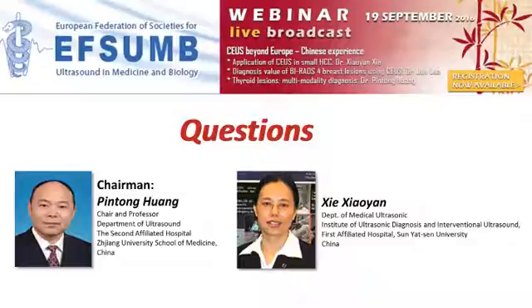It takes about 2 minutes, which is enough, because we have animal experiments. We know that when I use the ablation mode, we can occlude vessels up to a size of 1.5, which is useful. So I have confidence in that. Yes, we did the experiment in pigs.